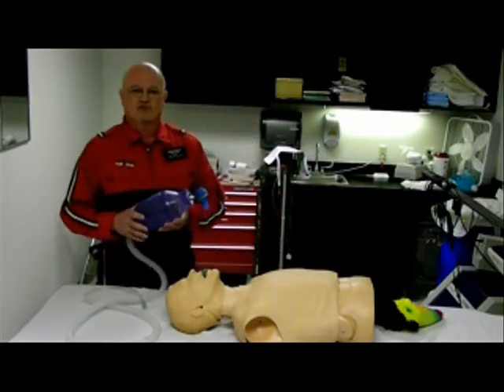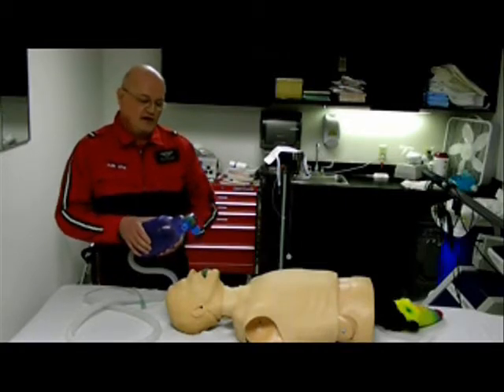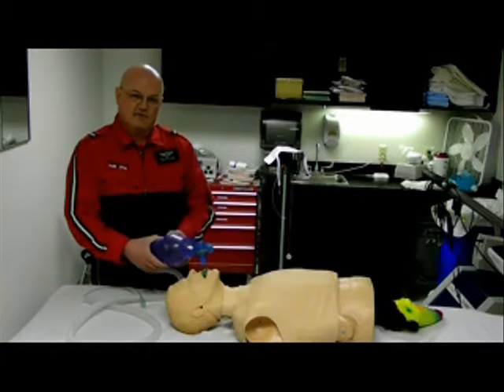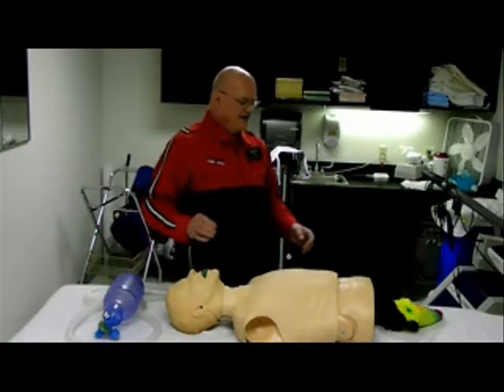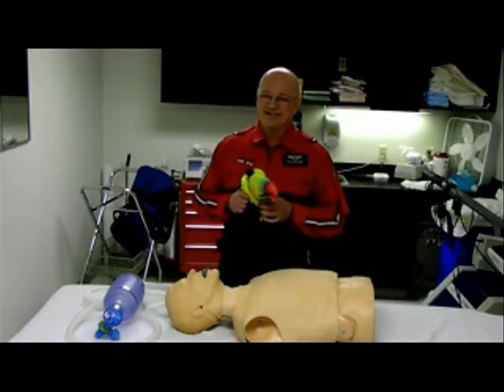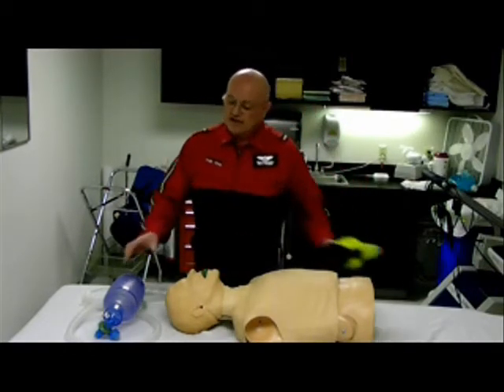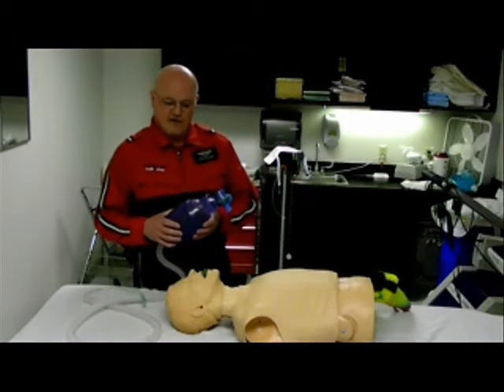If you have small hands, like toucan, you can use both hands to ventilate the bag, but only halfway. Toucan doesn't really have hands — he has wings. So he'd have to use his small feet to ventilate with the bag, but only halfway.